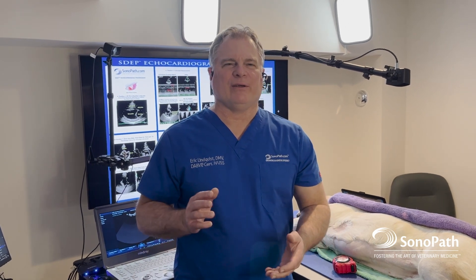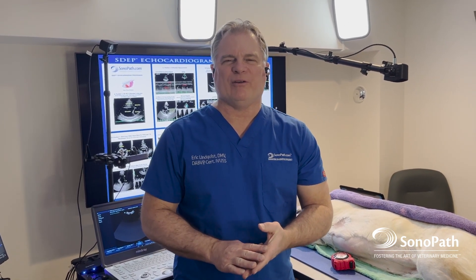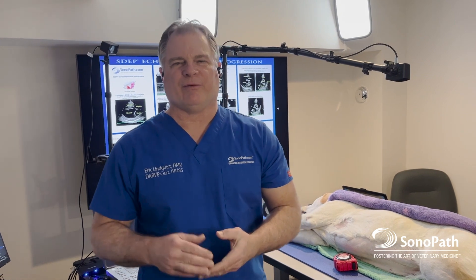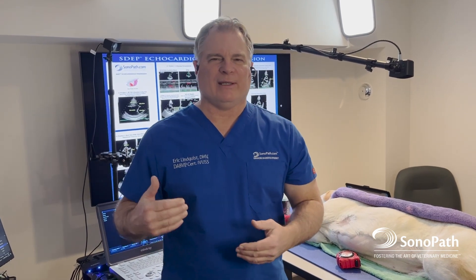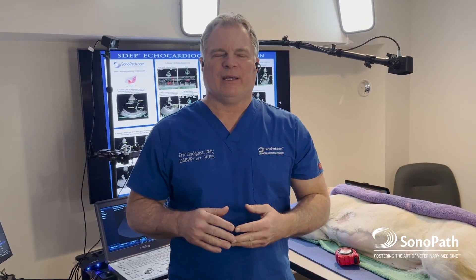Hey guys, this is Dr. Eric Lindquist. I'm here to talk to you about image optimization from both a conceptual, theoretical, and manual approach.